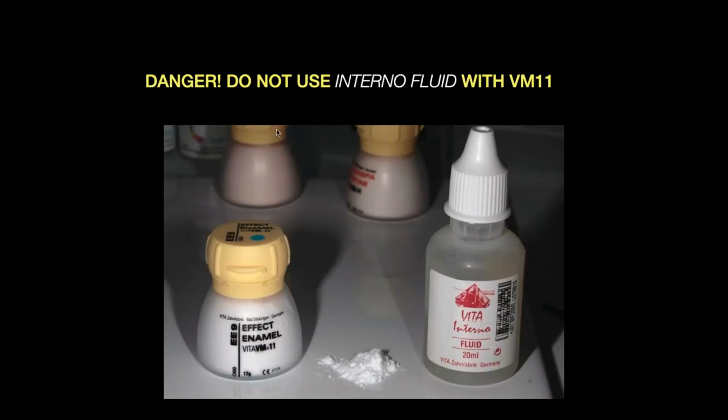And then I build them up with VM11. So this is a new material that is, the expansion is matched to the Suprinity material, which is a lithium silicate, and it's a little bit higher than zirconia. That's why you have to use VM9 for zirconia. You use VM11 for Suprinity. You cannot use Lumex on Suprinity. It won't work. Some people will try it. Go ahead and do what you want, but I know what's going to happen later.